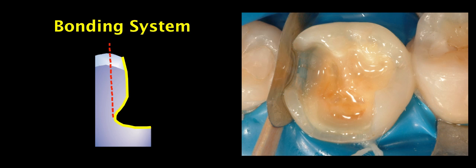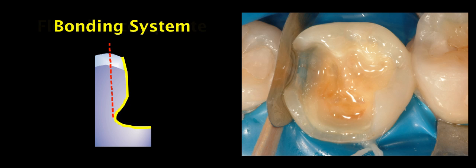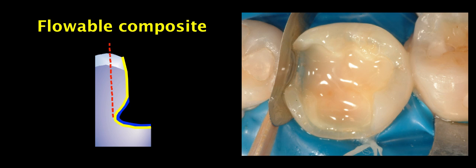The first step is to place our bonding system. For dentin I prefer using two-step self-etching bonding system so we see that after placement they perfectly reflect the light showing they've been applied to all the surface of the dentin. Then a thin layer of flowable composite is being placed on top of it. This can be considered as the last step of our bonding procedure just to stabilize our bonding agent.